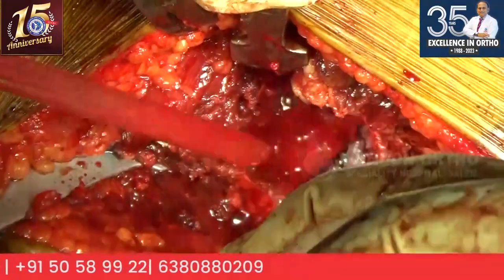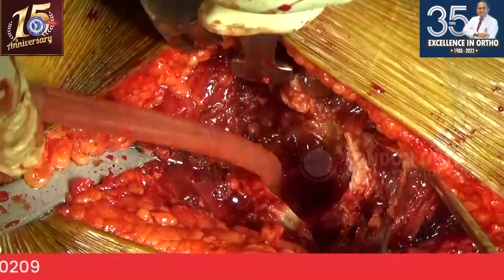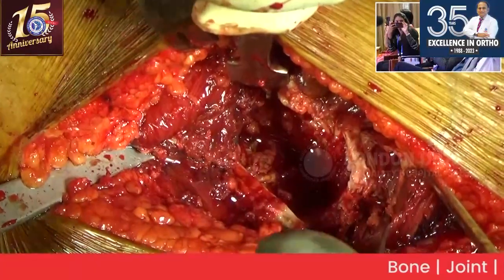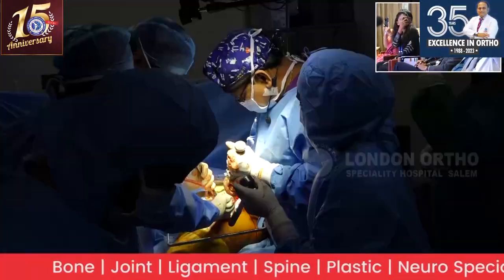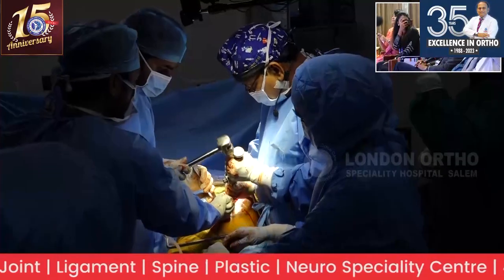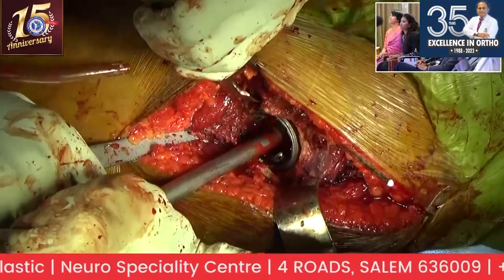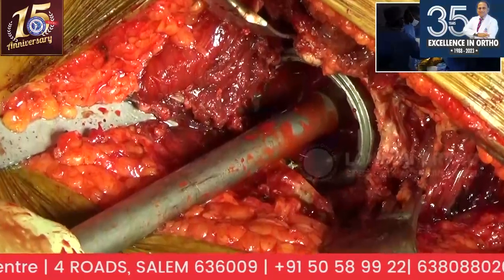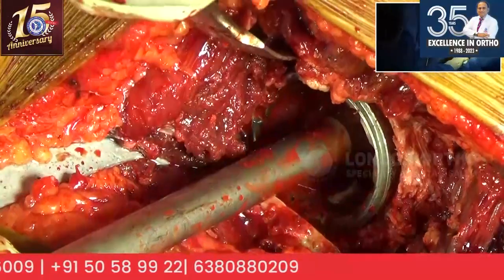What cup is this? No. Cup is 46. No, what company makes it? TTK. TTK, okay. What's the brand name? Transition cup. Transition cup, okay. Okay, hit it. Okay. A little bit of traction. Like this.